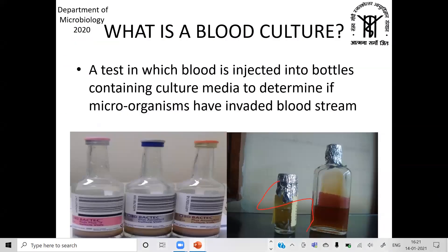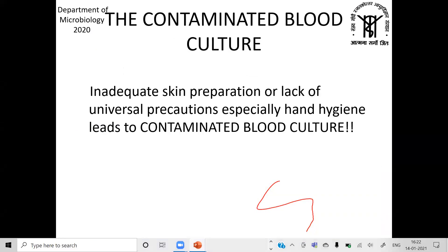We have stopped using the routine culture bottles and now use automated bottles. The first is the pediatric vial, the second is the aerobic vial, and the third is the anaerobic vial with an orange cap. Please avoid putting stickers on the bar code, as the machine reads it — a very common error is placing a sticker on the bar code, which prevents scanning by the machine.